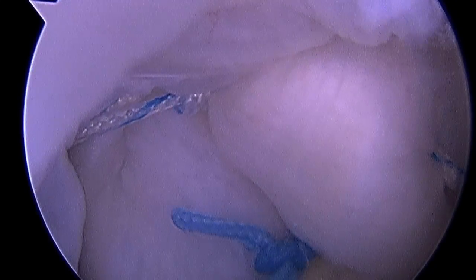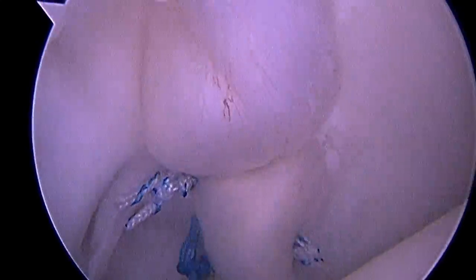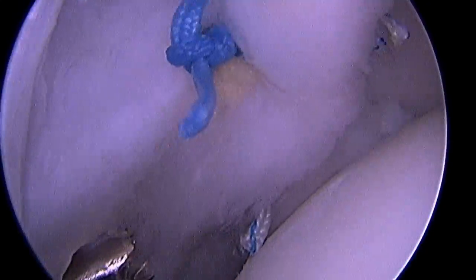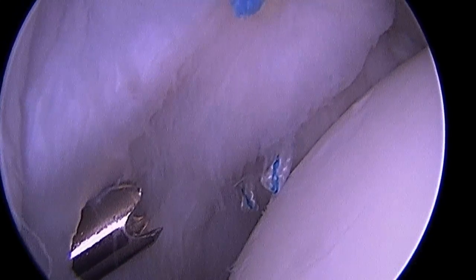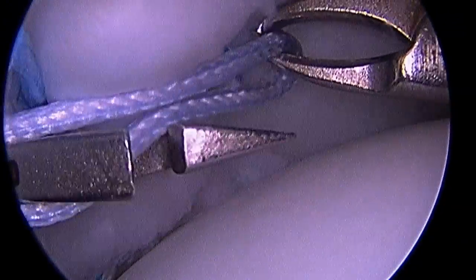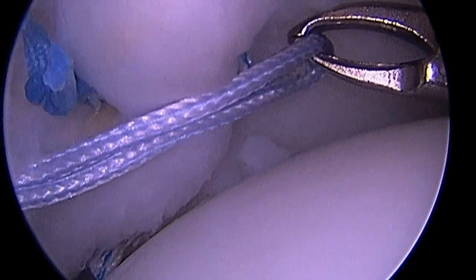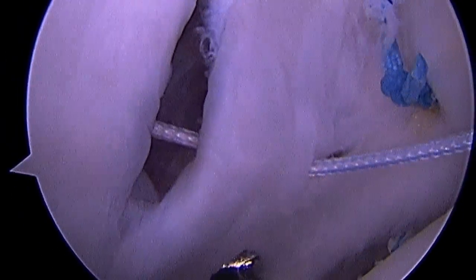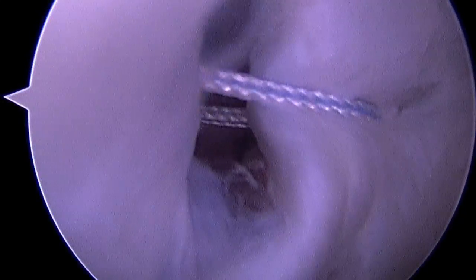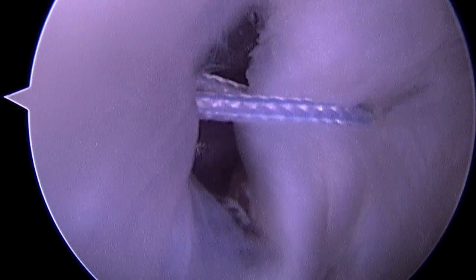So now we've restored the bumper effect of the labrum and posterior ligaments, and we've tightened up the posterior capsule. All that's left to do is repair the small amount of trauma from the surgery itself. You'll see to the left there's a small hole in the capsule. We're going to place a stitch on either side of that hole, and then you'll see when I tie that stitch down how we can close down the portal and minimize the trauma of the surgery itself. So let's look again at a before picture of the reverse Bankart tear — the ligament and labrum on the left, the glenoid on the right.